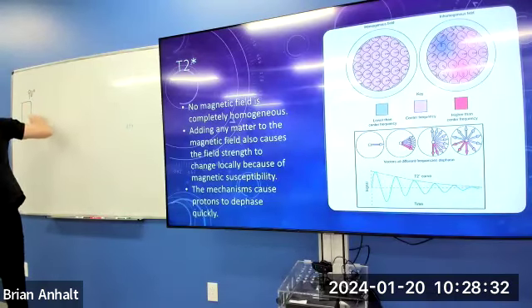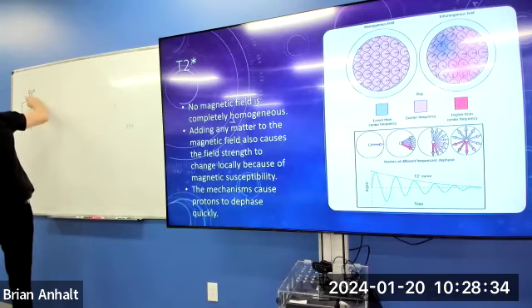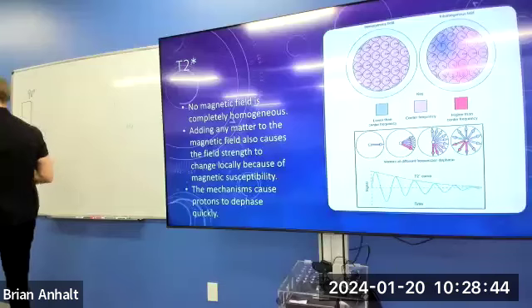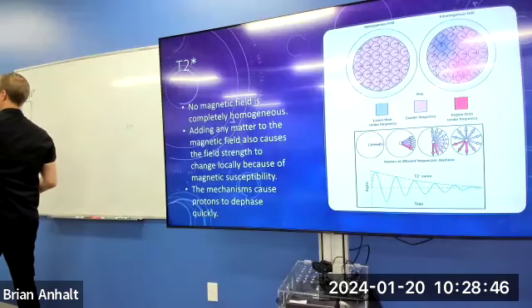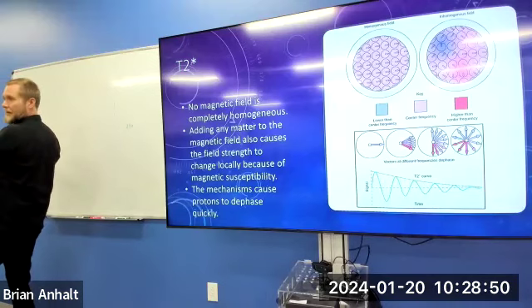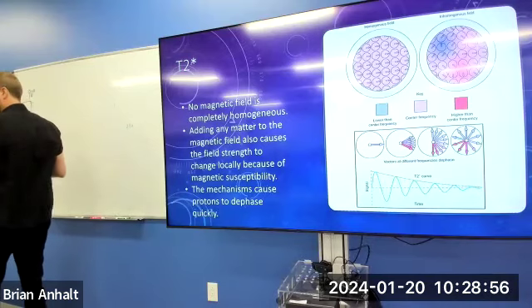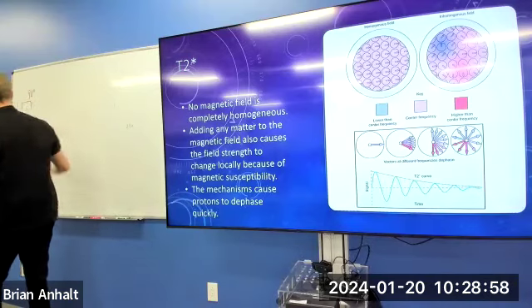Let's say we turn on our receive coil right away, we would see a lot of magnetization, decaying very quickly. We'd have a lot of current induced in our coil, and then it would go less and less and less until there was nothing, because we are losing that transverse magnetization. We're losing that oscillating transverse magnetic field.